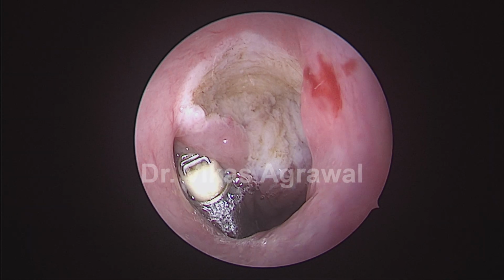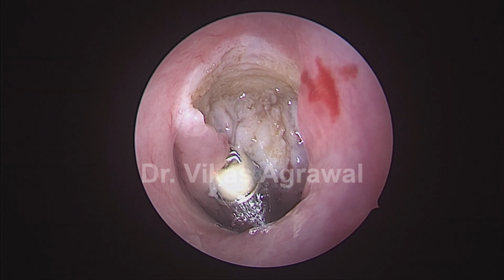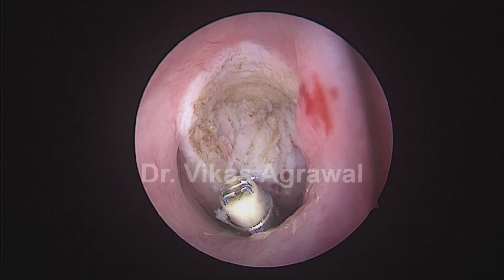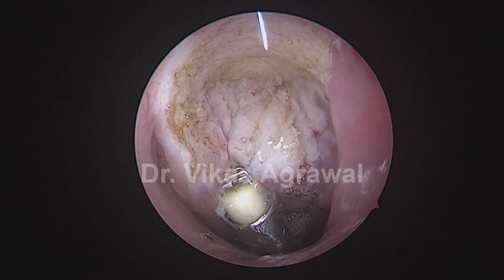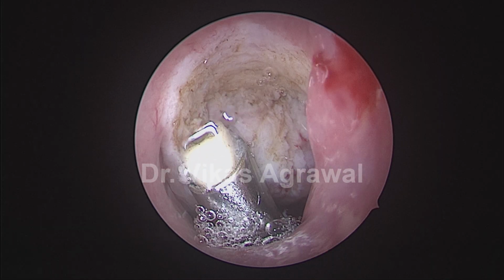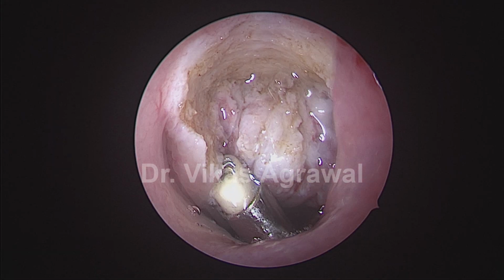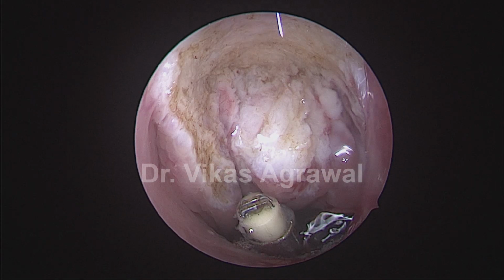This is the eustachian tube orifice, this is the torus tubaris, and the lateral boundary anteriorly is the tubal tonsil or torus tubaris. So, I am removing the lymphoid tissues, sparing 5 millimeter from the eustachian tube orifice. I am removing all the lymphoid tissues, but I'm not getting into the muscle. So this is the lateral boundary anteriorly. Make sure that you do not damage the back surface of the soft palate.